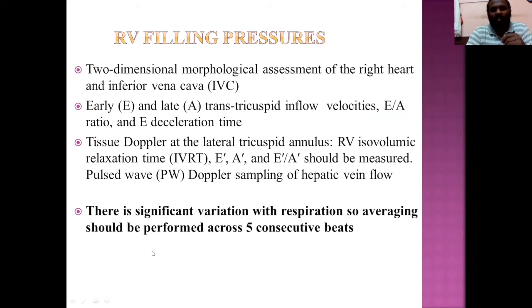Now, what happens to the RV filling pressures? As in LV filling, there are no formal guidelines which guide you for assessment of RA filling pressure. So we try to measure what we measure on the LV side, and from that we are trying to extrapolate how we measure increase in LA pressure. We are trying to measure the RA pressures.